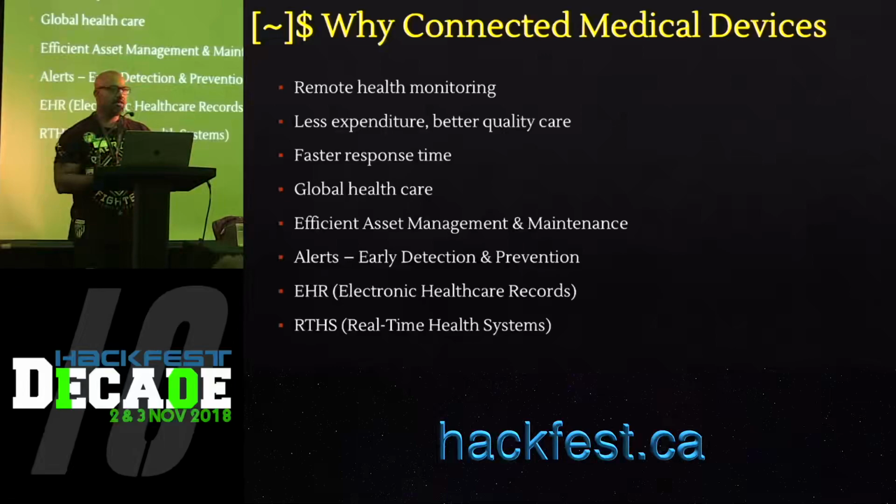Also, he mentioned that from their CISO's perspective, because they still have unpatched systems and older operating systems on their medical devices, the CISO's priority is to patch those systems. Their priority is to patch or get rid of Windows XP, Windows 2000, 2003, and not the medical devices. So we'll get to the medical devices, but it's going to take a long time to get there, which is an interesting conversation to have.